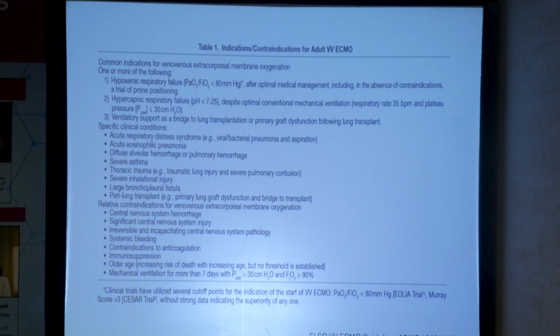You see number 1 at the top there: hypoxemic respiratory failure, P to F less than 80 after optimal medical management, including a trial of prone positioning. So they give a strong endorsement to prone positioning. That's the best evidence-based treatment of what we reviewed yesterday for ARDS. And they give a vague optimal medical management to show you that you shouldn't just immediately put somebody on ECMO because they have ARDS, because there are lots of things, prone positioning, recruitment maneuvers, paralysis, PEEP titration, that may be able to stabilize a patient and avoid the invasiveness of ECMO.